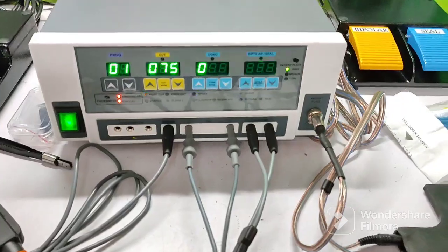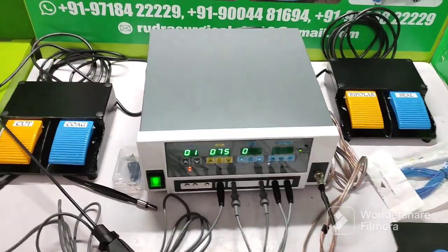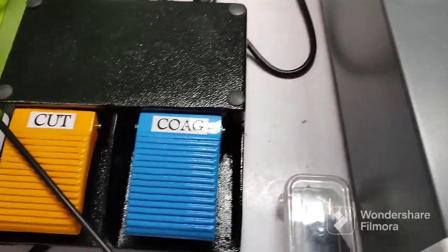We have cut mode, coag mode, and bipolar mode. This is the bipolar switch cutter and this is the monopolar.